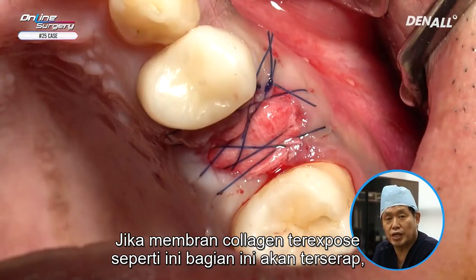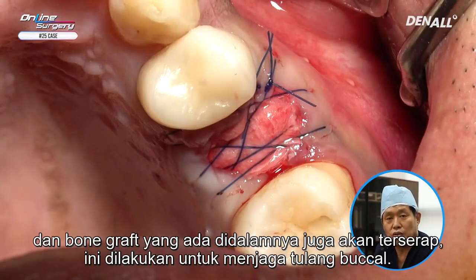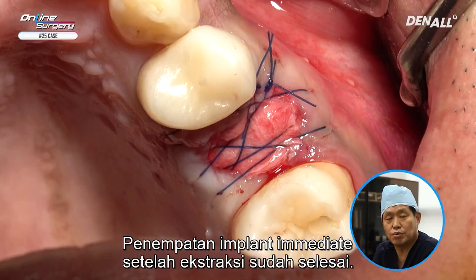If collagen membrane is exposed like this, that part will be resorbed and the bone graft superior to that will be resorbed, but this was done to maintain the buccal bone. Immediate implantation after extraction has been demonstrated.